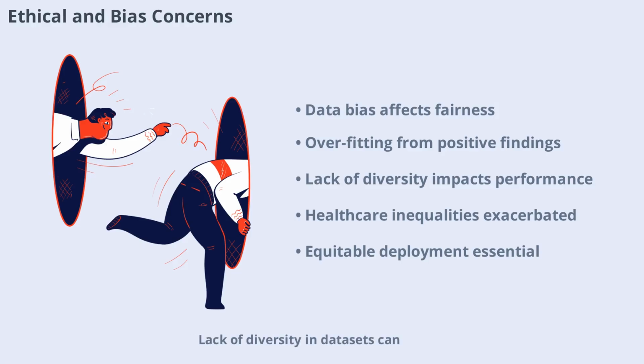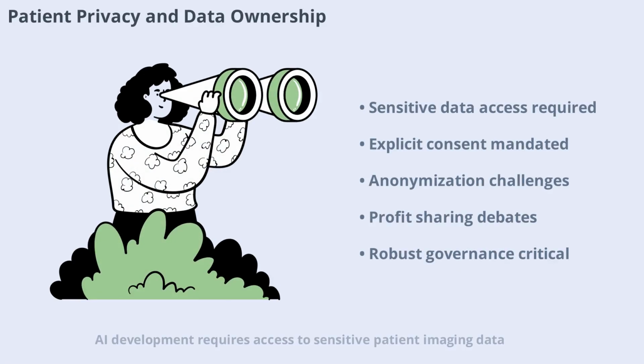Lack of diversity in datasets can result in poor performance for underrepresented groups, exacerbating healthcare inequalities. Addressing these concerns is essential for equitable AI deployment and protecting patient welfare. AI development requires access to sensitive patient imaging data, raising privacy and ownership concerns.